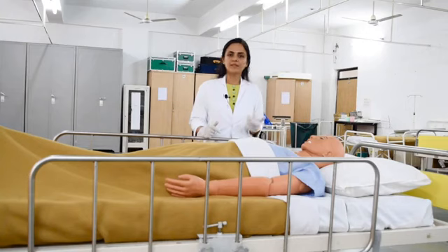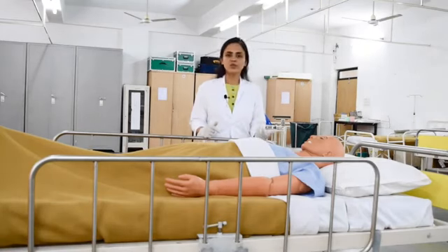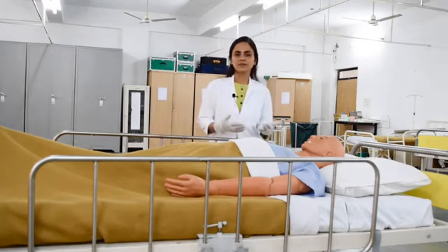Because in some cases, if we are dealing with a fractured patient or an operated patient, some parts of the body we have to keep immobile. So these orders we have to check before starting the procedure of occupied bed.